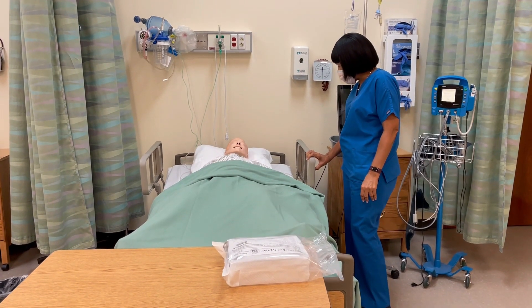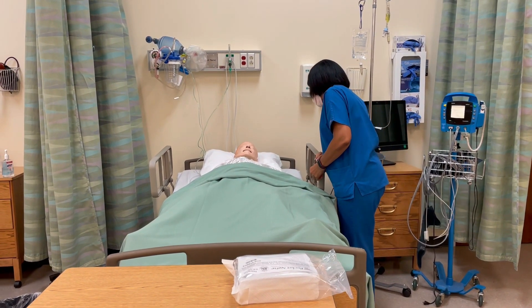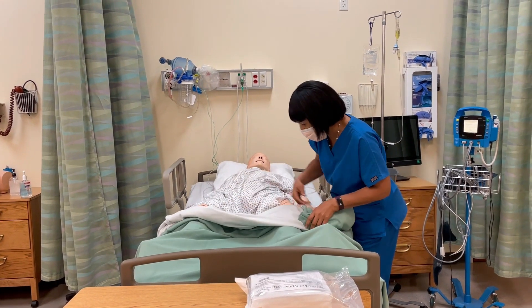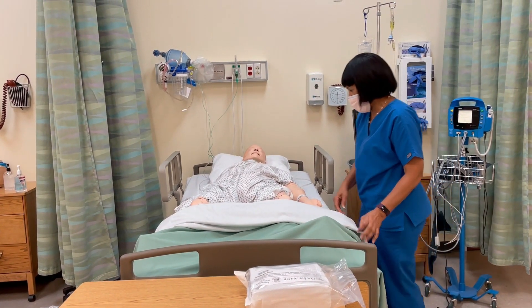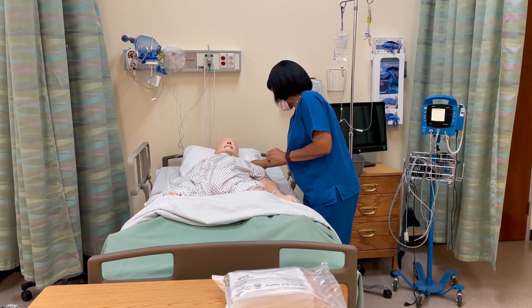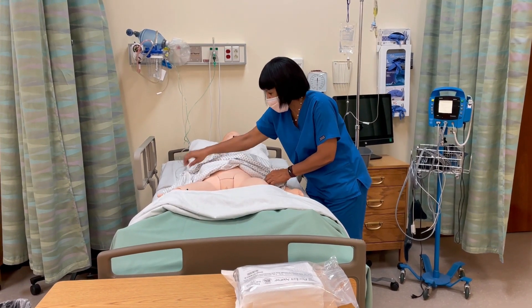My name is Sharon. I'm the nurse who's going to be caring for you today. How are you doing today? The doctor asked me to put a catheter in your bladder so we can get rid of the urine that you're having problems with. I'm going to pull back your sheet here. Is that alright with you? You told me you already washed it, so I'm going to put your gown up. Is that alright with you? Female, okay, so I'm going to do that.